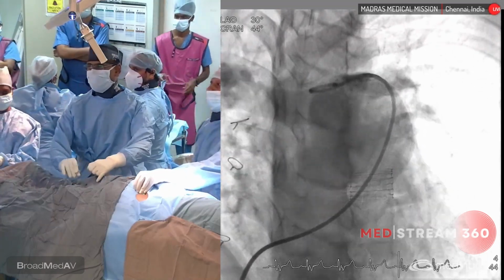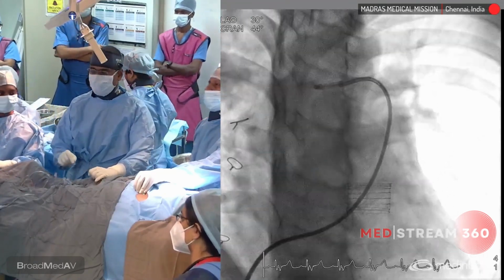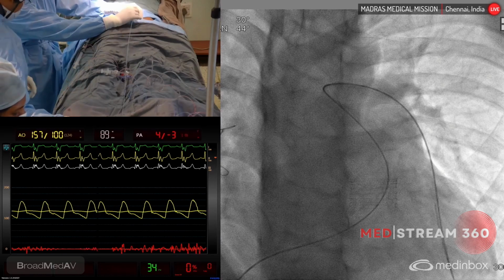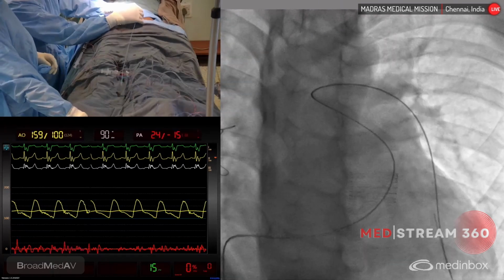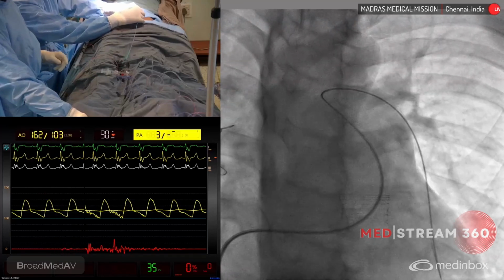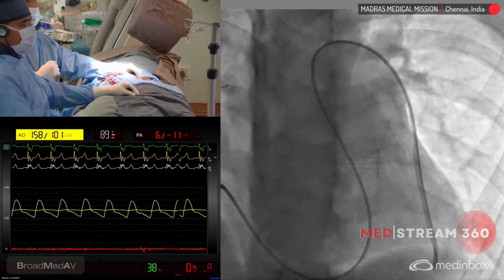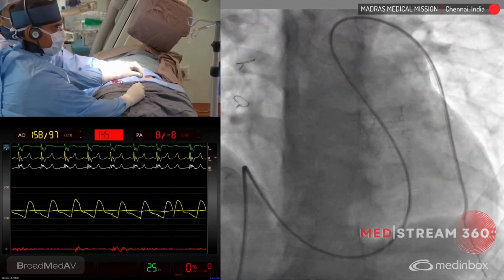I'm able to see the left pulmonary artery just coming out of the main pulmonary artery. So the plan will be to place a stent at the origin of the left pulmonary artery and the mediastinal part of the left pulmonary artery. Dr. Pramod, you mentioned that the hilar part of the left pulmonary artery was as big as 18 millimeters in the maximally dilated projection. So let us target an 18 millimeter stent. Let's try to go as deep as possible.